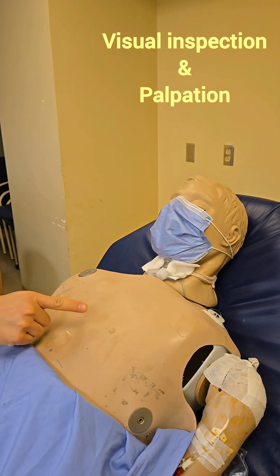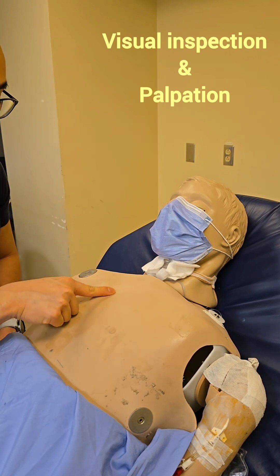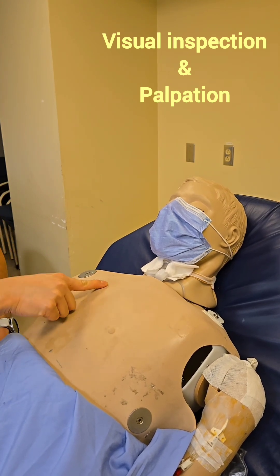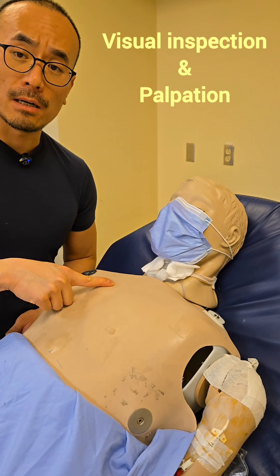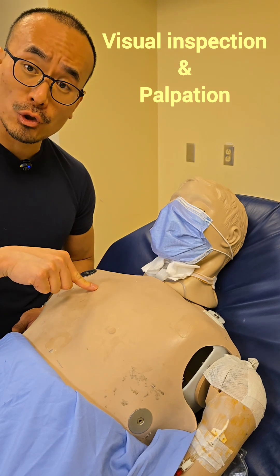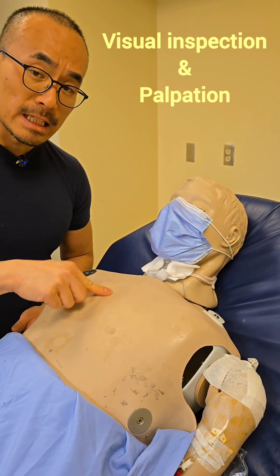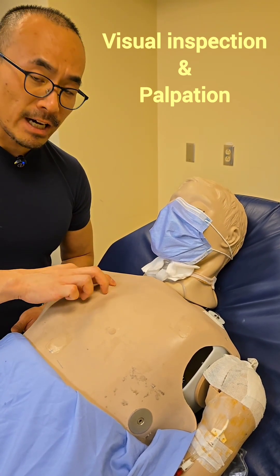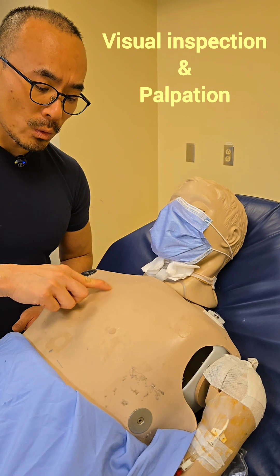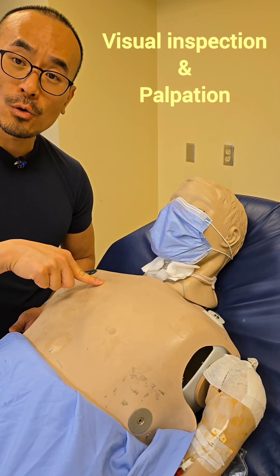We're going to start by doing a visual inspection. Sometimes if the portacath has been accessed before you can see needle punctures. The best way is always to go by palpation — you just palpate around and you will feel a little raised bump. On some patients who are skinnier or have less subcutaneous tissue, you might actually be able to see the portacath visually. The needle is going to go right in the middle of the device, so palpating and having a better feel for it will allow you to find the center of the hub.